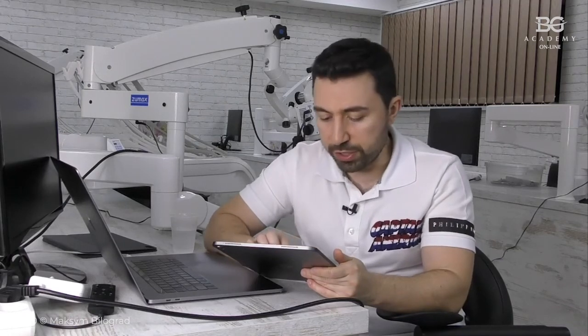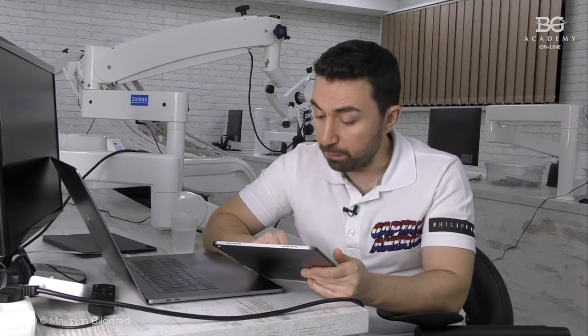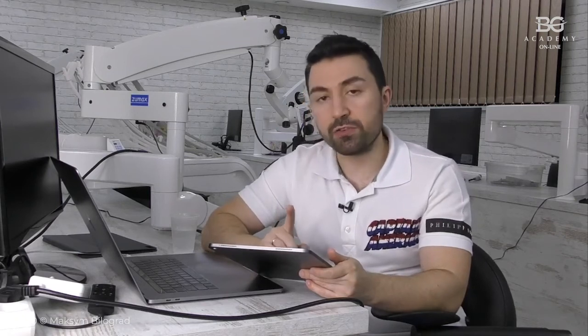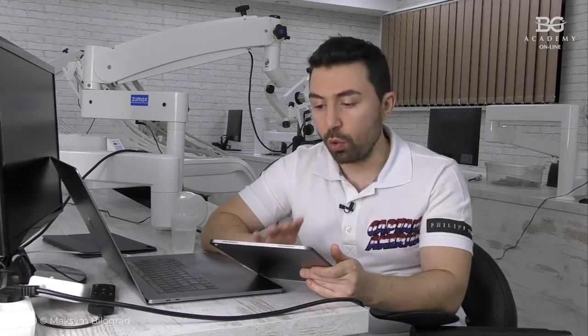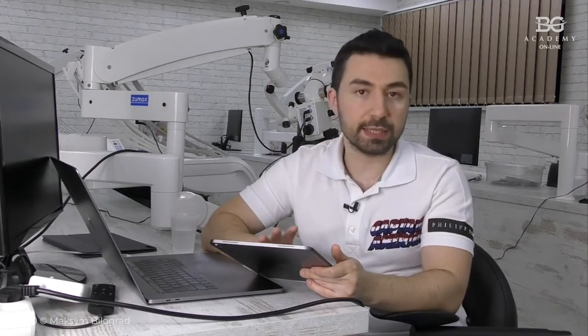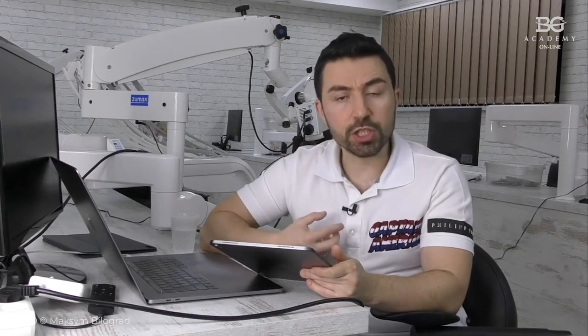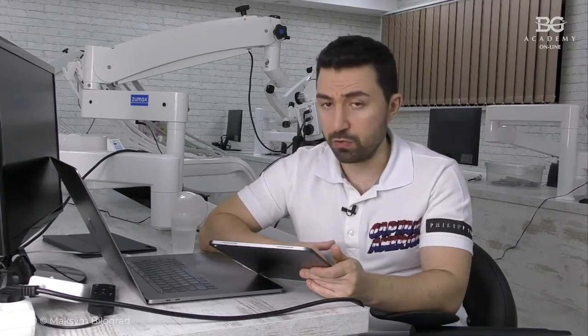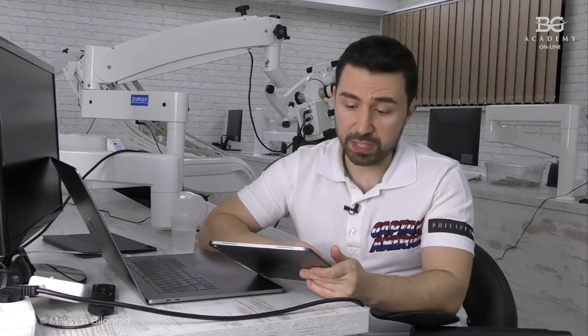On a very discolored tooth, would you prefer to use opaque composite? Actually, I answered this question regarding discoloration. We do cases with discoloration, and all responsibility comes to the dental technician. From my side, I have to provide information about the tooth, and the dental technician selects the proper ceramic opacity in order to get this case done. So I'm not experimenting with opaque cements trying to mask discoloration. We select the proper ceramic shade and also the type of opacity of the ceramics.